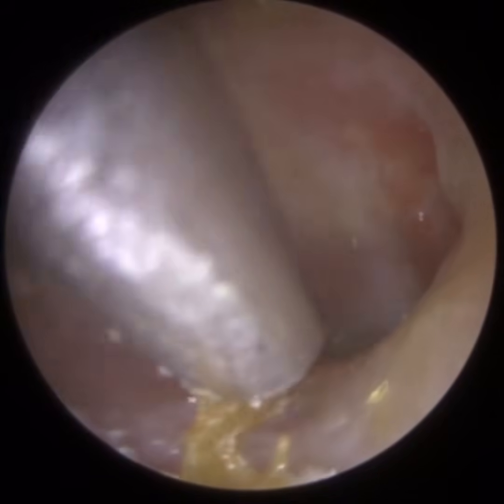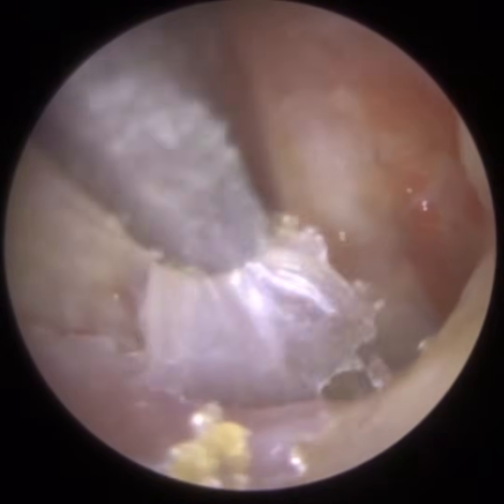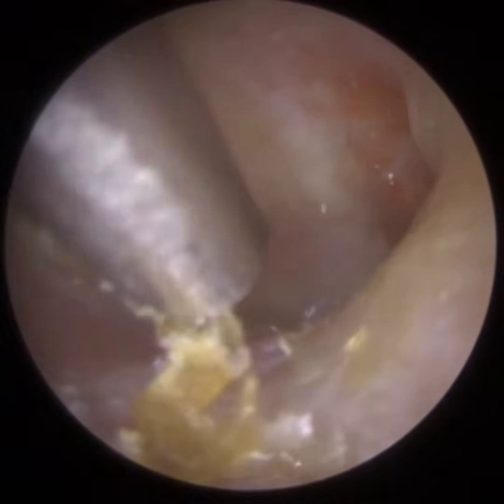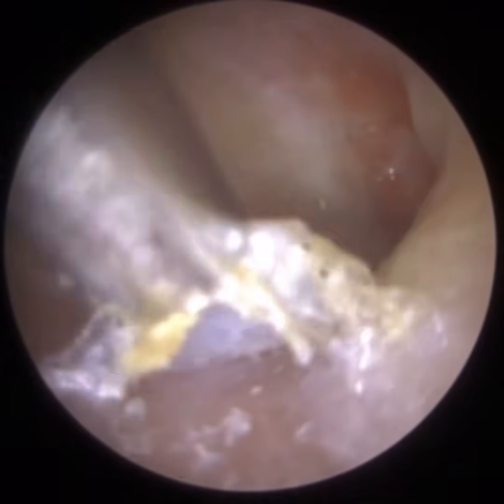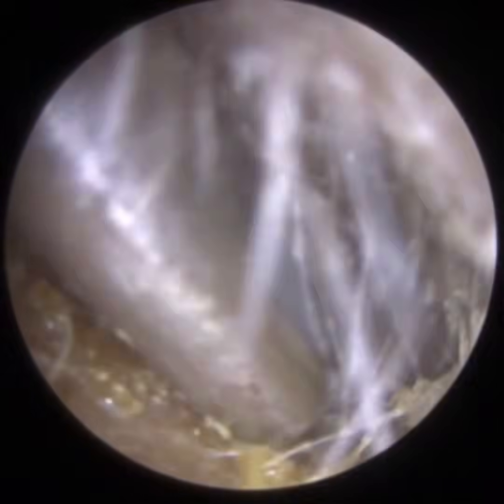And in the inferior recess, you can often, it's almost like a hideaway. It's a trench, as I mentioned before. It's very hard to visualise inside that. You can probably see that where we are now, the ear canal suddenly drops where the skin is, it goes down. And you can get a substantial buildup of dead skin. In a minute, you will see me remove a huge amount of dead skin. It'll be very surprising when you see it, because you'll be wondering where on earth all this skin came from. It's not visible to the naked eye until we peel it out of the inferior recess.